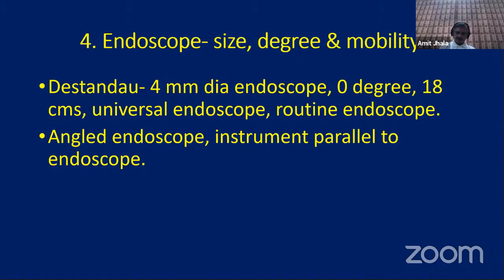Yeah, I'll just add one thing. If somebody wants to go for an endoscopy, because now I am doing both, I am doing interlaminar endoscopy also, and microtubular also, because this is my transition. If you want to do posterior or transforaminal, that's a different thing. But if you are choosing your posterior technique as your main principle, and you want to go for an endoscope, I think there is an advantage for the beginner, not for anybody who is already doing that technique.